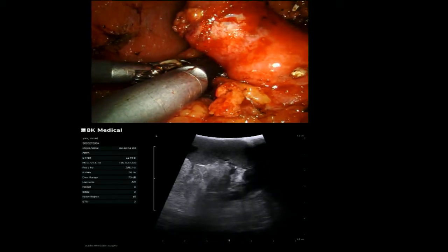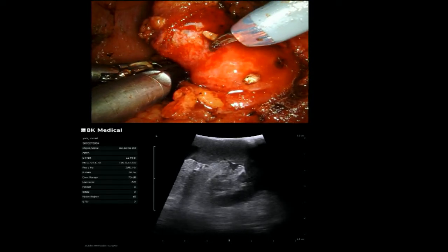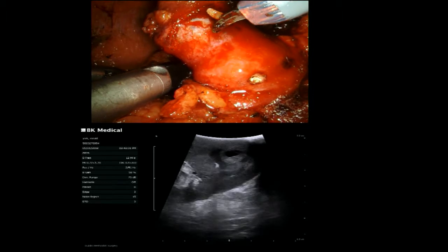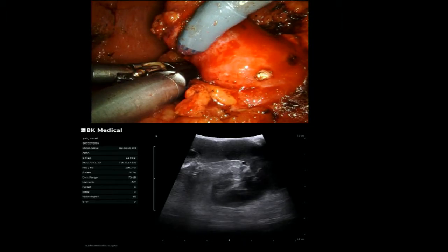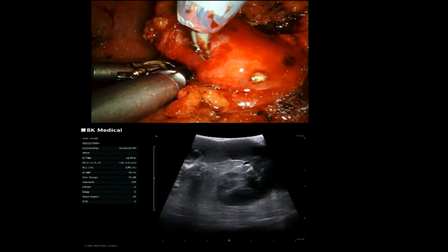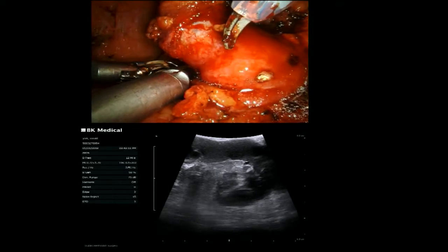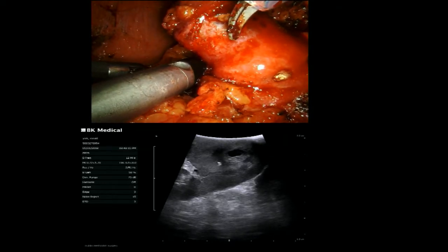That's good. So one thing that I'm doing with this probe, just to point out, is that I'm also rotating the head of the probe. So I'm placing it at where I plan to make my cut. I'm going to make my cut here. But I want to know, do I need to cut straight down like this, or can I cut more this way, or do I need to go more that way? So I'm rotating the head of the probe until I see the tumor. There's tumor there. And then I go away from it.